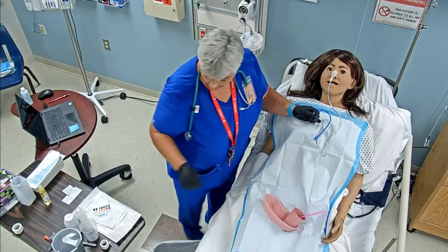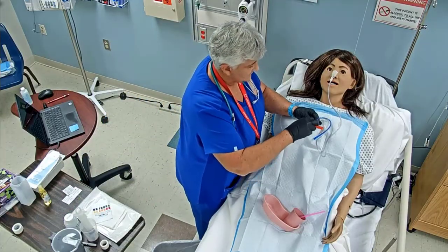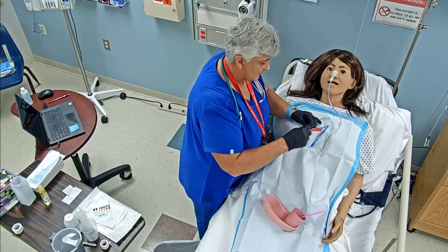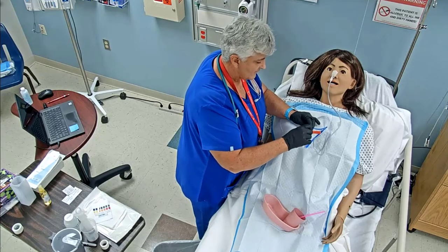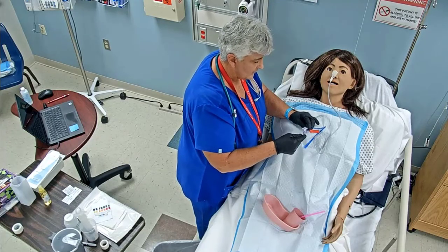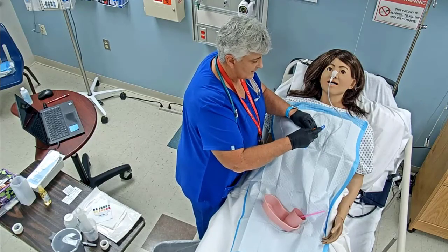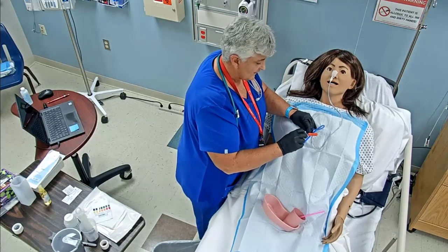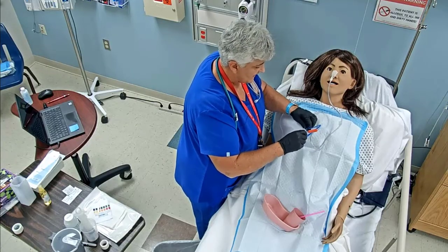I'm going to go ahead and put my Lopez valve in. It has several different stoppers here. This is the off button right here, and I've got it off. We can also hook up suction here if we need to, and we can connect our tubing for feedings here. So we're just going to make sure that it's off to where we need it, so we don't have that.